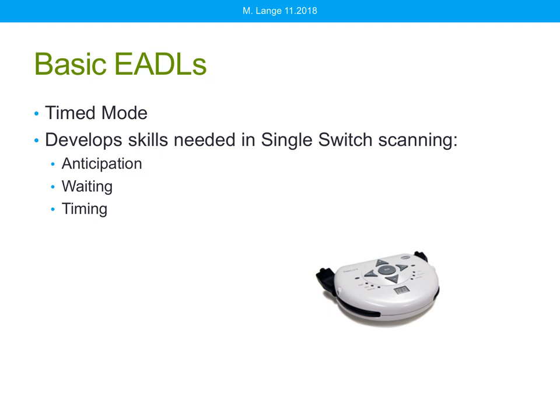Timed mode. In timed mode, a switch is plugged into the basic EADL, a switch latch and timer, or a power link, and then the controlled device, either a battery-operated toy or a simple electronic device, can be operated by that switch. By using timed mode, where the device stays on for a pre-programmed amount of time, let's say 10 seconds, we can develop specific skills needed for single switch scanning, primarily anticipation, waiting, and timing.